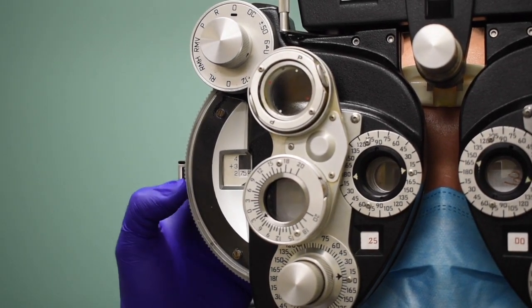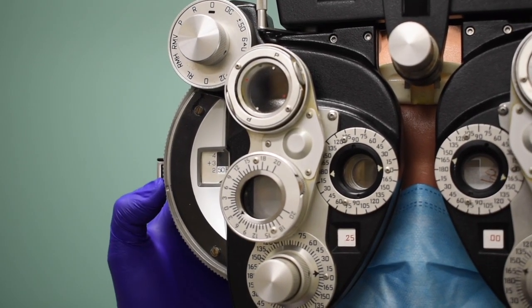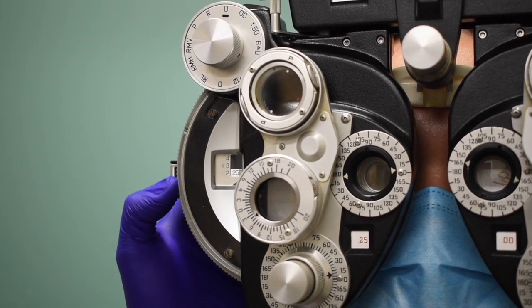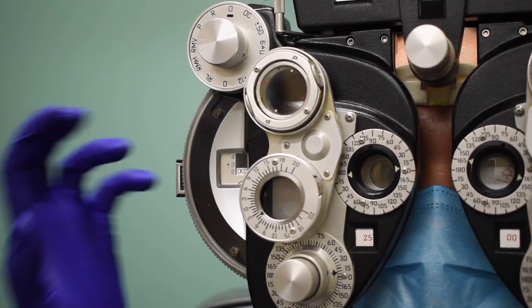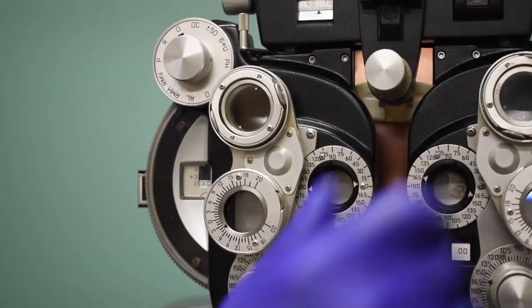Go two past. And tell me the first time you can make out one or two of those, Phoebe. Right here. Good. You'd record the plus two for the bichrome on the right eye.